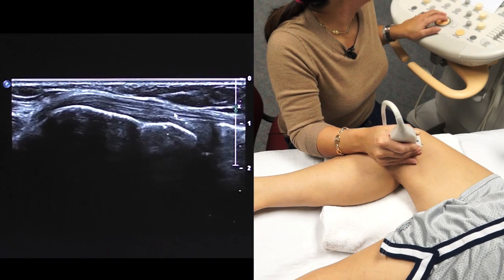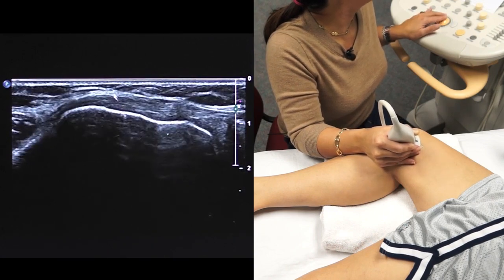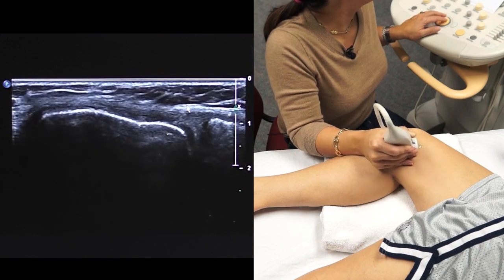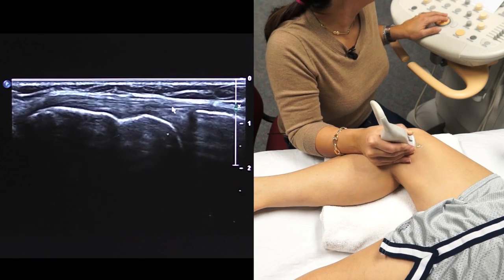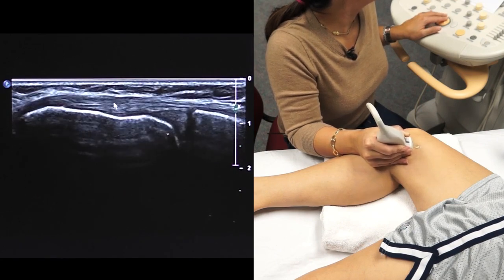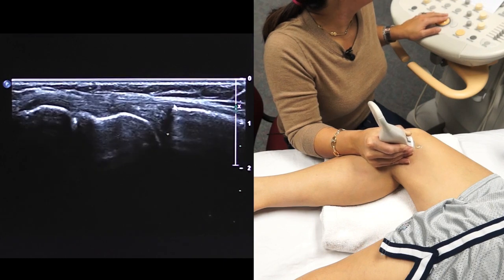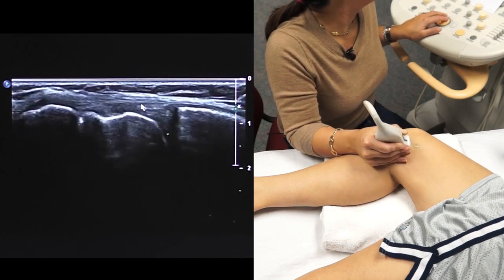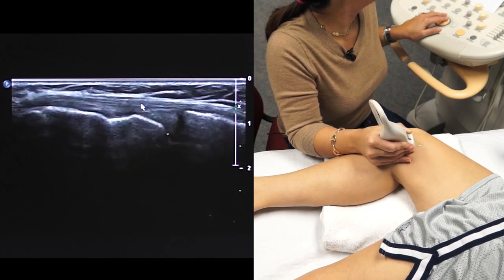Now you don't always see the retinaculum as a separate structure, but it is a thin structure that overlies this entire complex. Again, you want to scan anterior to posterior, looking for absence of the architecture, decreased echogenicity, or some irregularity signifying that there is surrounding fluid. But when there is an abnormality of the medial collateral ligament, that would imply that there are some other abnormalities in the knee.